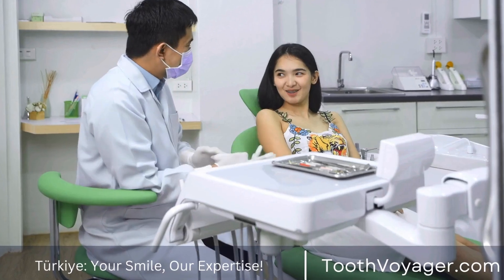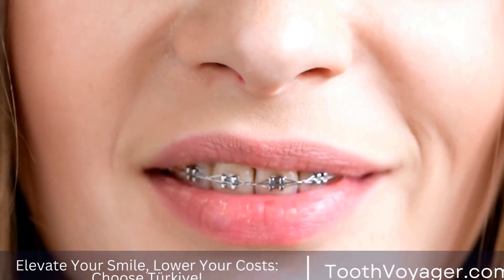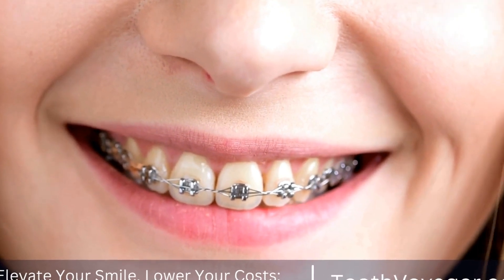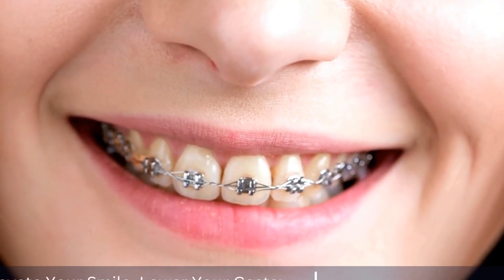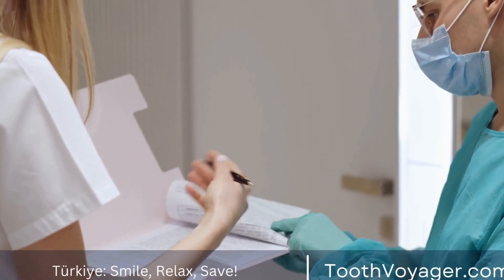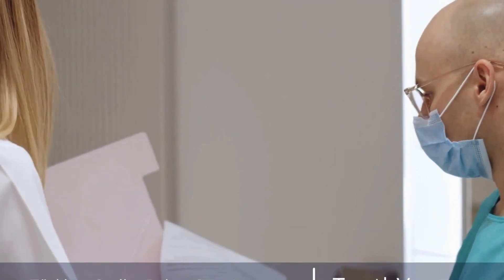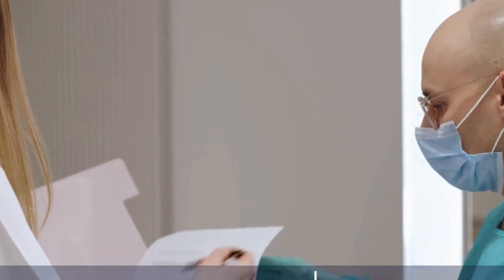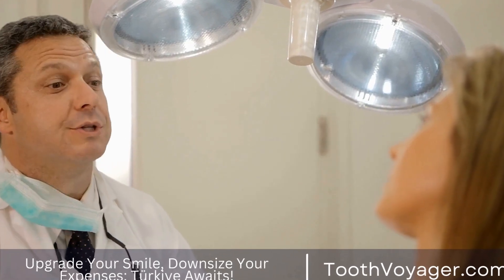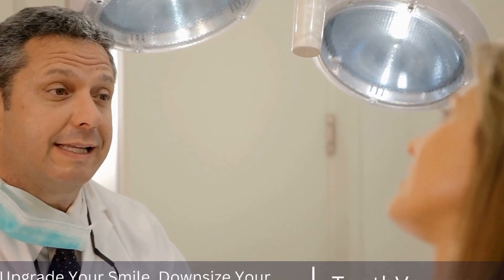Step 1: Consultation and Treatment Planning. The first step in the dental implant process is a consultation with a dentist or oral surgeon. During this consultation, the dentist will evaluate the patient's oral health and determine if they are a good candidate for dental implants. X-rays and scans may be taken to assess the condition of the jawbone and determine the best placement for the implants.